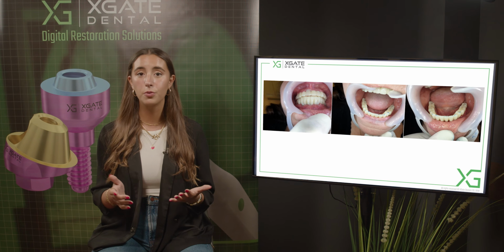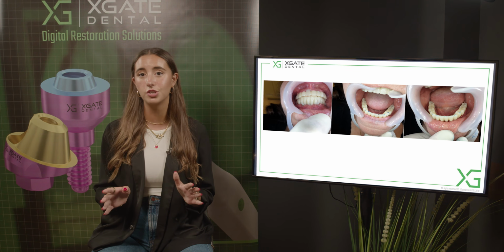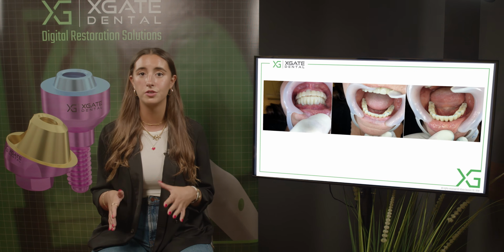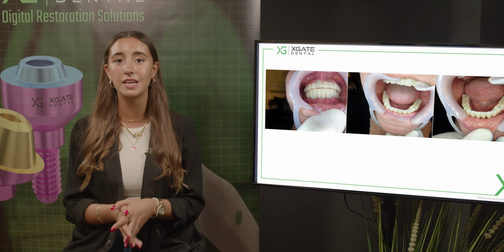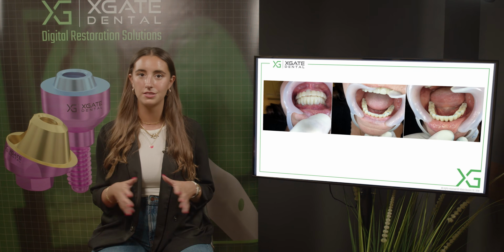A lot of contact points, which is quite good, not perfect, but the central line, all of the restoration itself, the aesthetical part, the functional part, is not bad for a provisional restoration for the first bridge that you have after you took impressions on the implants that were immediately placed and immediately restored. It's not easy to get this type of contact.